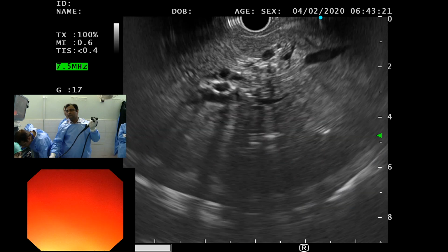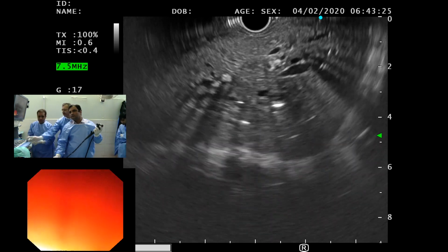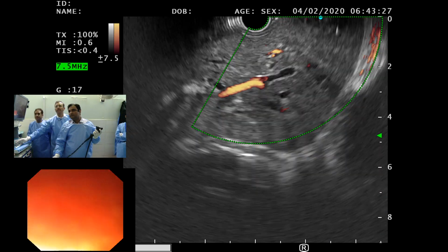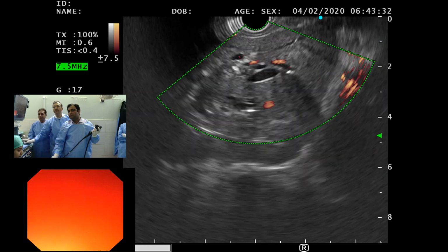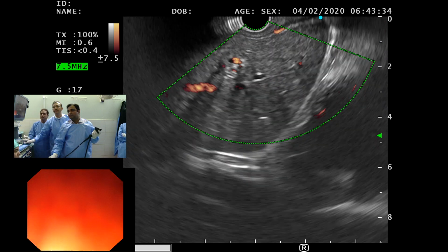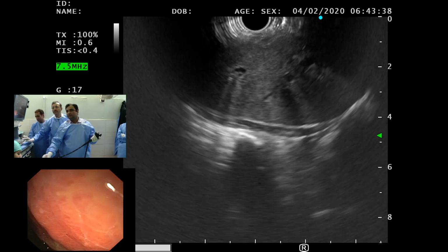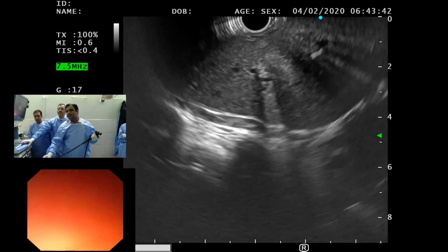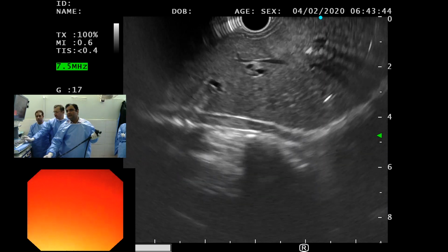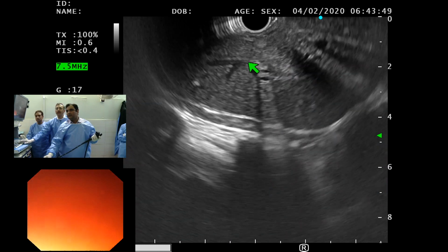Can we put Doppler on it, please? Yes, certainly. This is left hepatic, that's right.